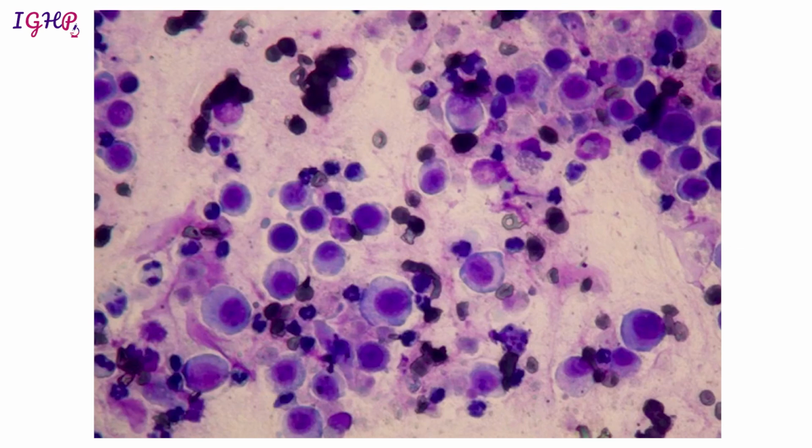Now from the same lesion, suppose we get a sample like this. We are getting multiple plasma cells, occasional lymphoid cells also, an inflammatory smear full of inflammatory cells, so this inflammation can explain the mass in the head of the pancreas. And since we are seeing a predominance of plasma cells, we are now thinking along the lines of autoimmune pancreatitis also. So for this case we would like to get a cell block to do IgG and IgG4, and if possible they can do an EUS-guided biopsy also, that is called EUS biopsy. But since they are very thin cores, they are generally fragmented, so it is difficult to interpret them.